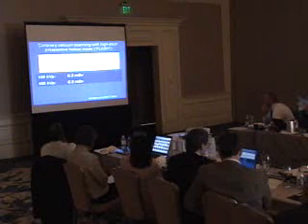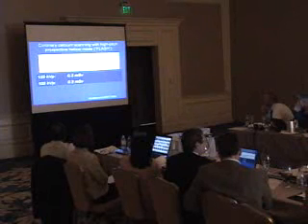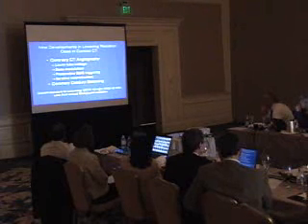Stefan Achenbach's group has shown that with either of the voltages that I talked about, calcium scanning can now be performed at levels of 0.2 and 0.3 millisieverts of radiation.